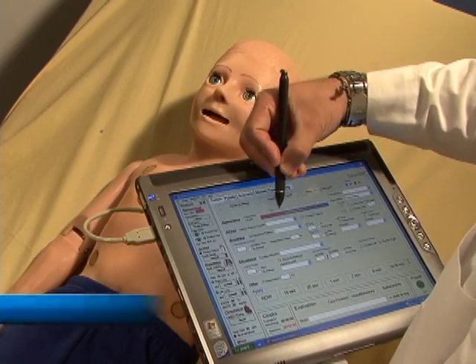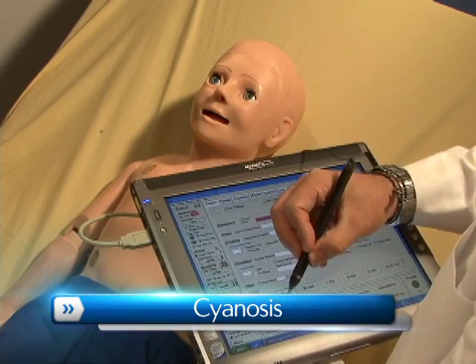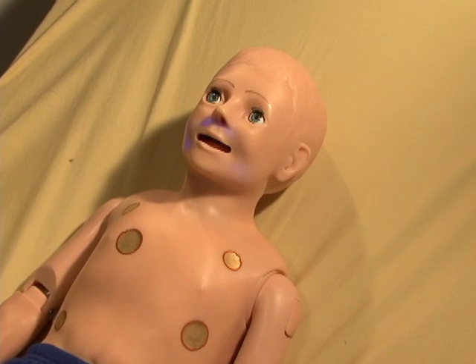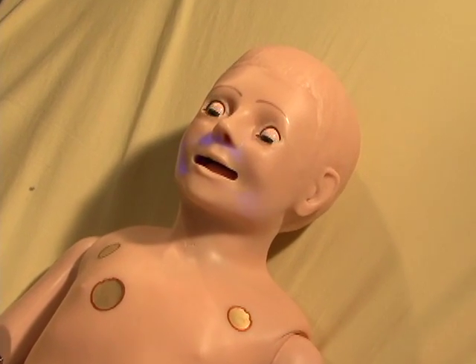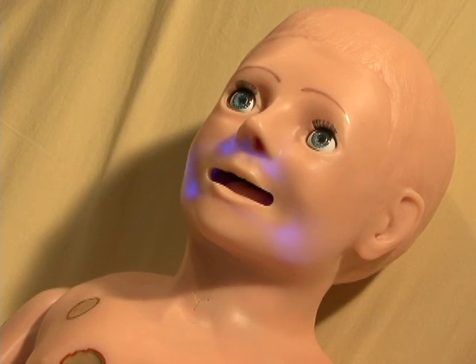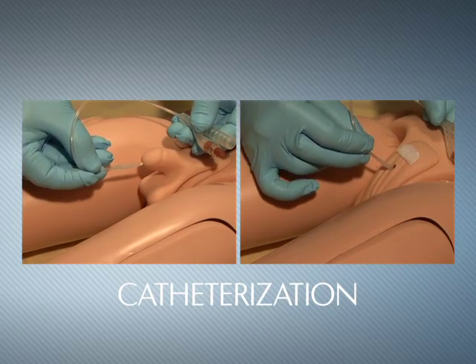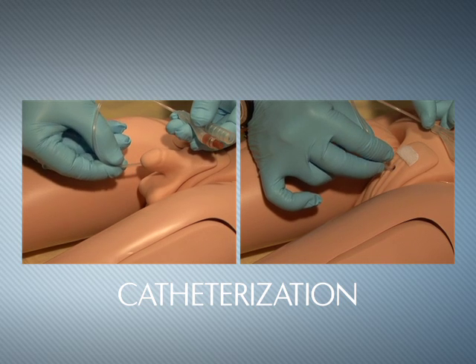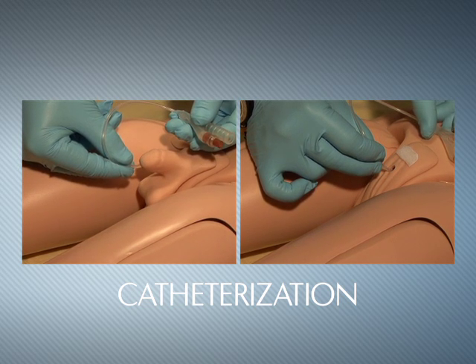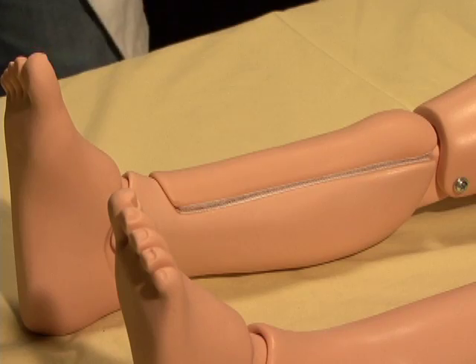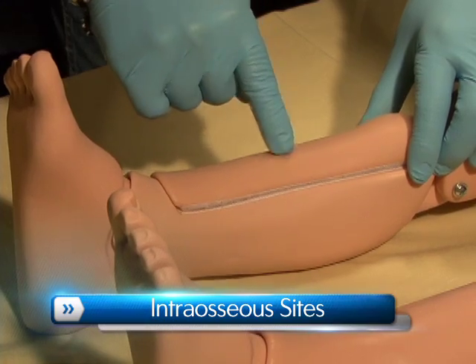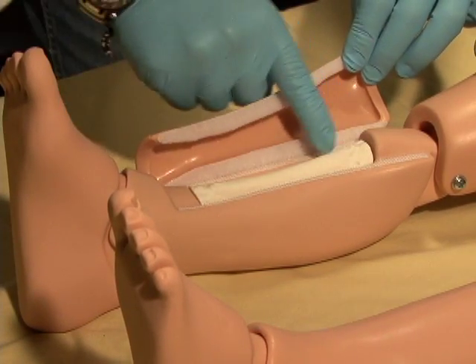Our new cyanosis feature allows the user to control the pallor of pediatric HAL's skin when hypoxic events occur. Pediatric HAL can be catheterized via exchangeable male and female genitalia. The lower right leg has an intraosseous injection site with replaceable tibia bones.